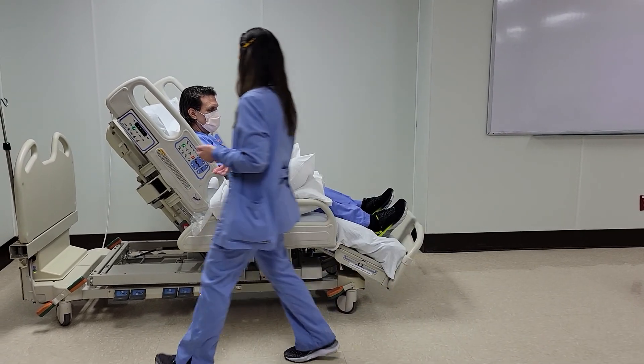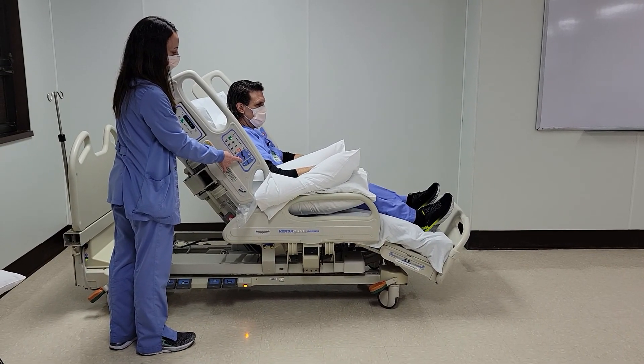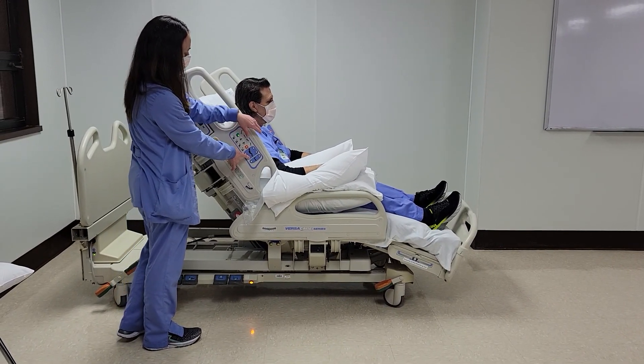To get out of the cardiac chair position, you're just going to flatten the bed all the way. This is going to take a moment.